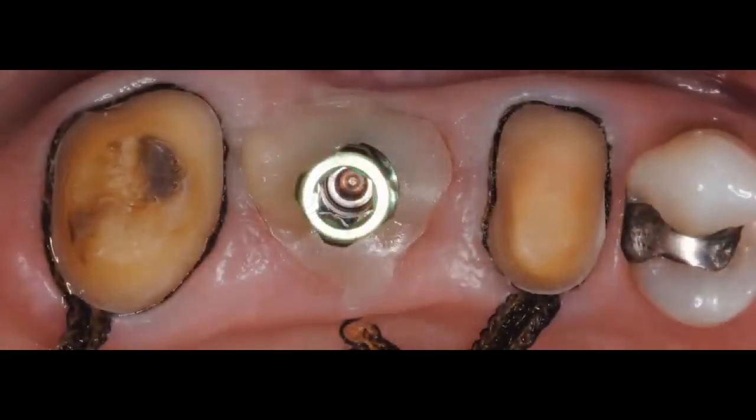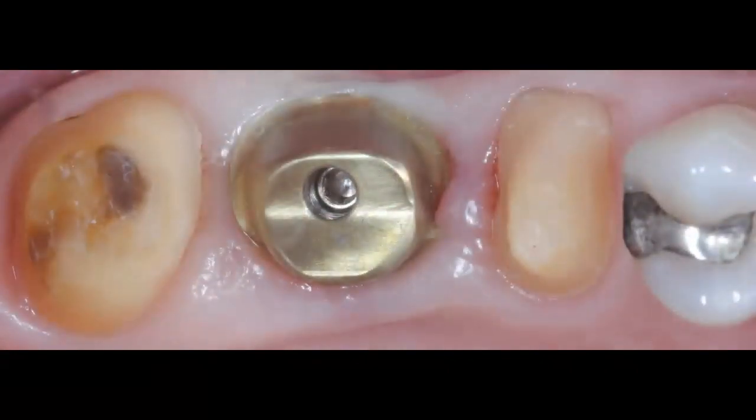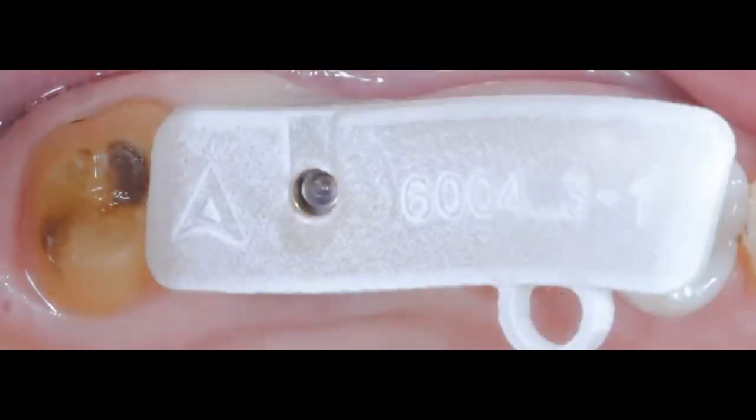Here now we're ready 6 months later to place our final restorations. You can see that the location of the implant, we've added some composite to the implant just to take an impression of our emergence profile. And then we are ready to sit the actual custom healing abutment. We use an Atlantis abutment for this case, and we fabricated 3 individual zirconia crowns, which was better than having a 3-unit bridge for our patient there. Easier for our patient to clean that area, and obviously she can now floss and she can just enjoy, I would say, that new tooth.